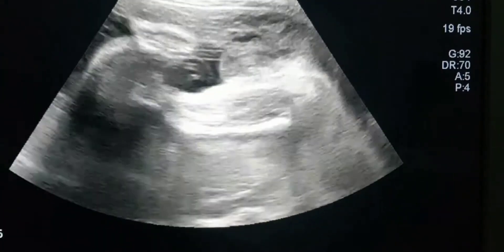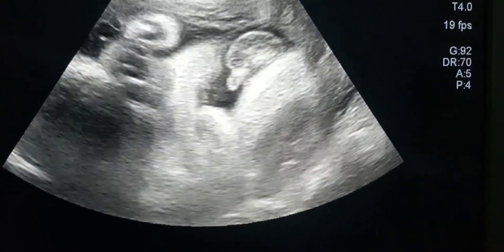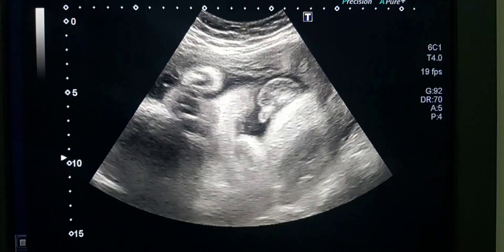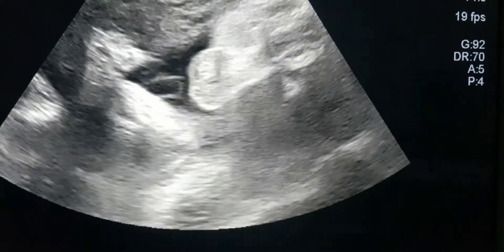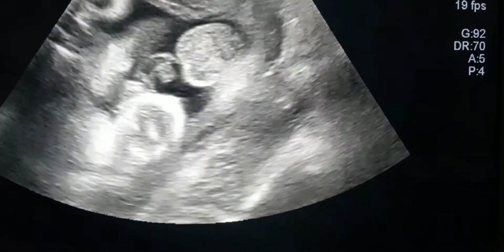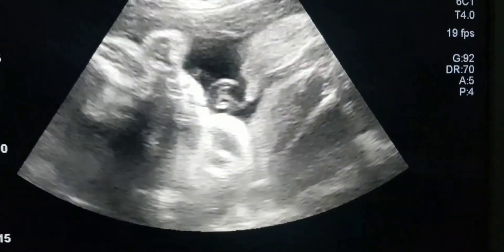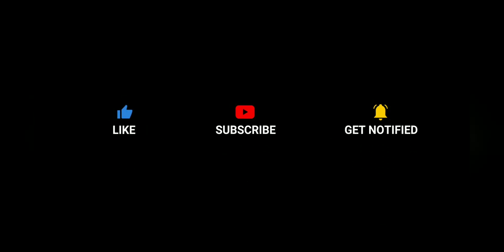So if you are scanning at the end of the first trimester or the second trimester, you have to focus on the genital tubercle and its direction. But at the end of the second trimester and in the third trimester, you can easily recognize the fetal sex organs and tell the fetal sex 100% accurately. Like in this case, scanned at 25 weeks of pregnancy, you can easily recognize the scrotum and penile tissue and confidently tell this is a male baby.